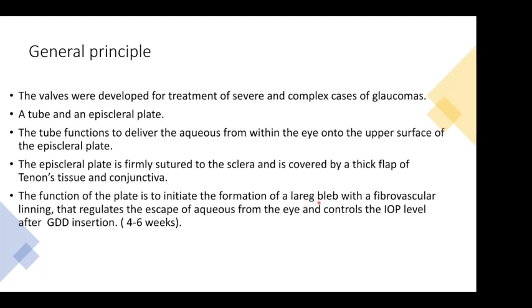The general principle of a valve is that valves are generally developed for the treatment of complex cases of glaucoma.